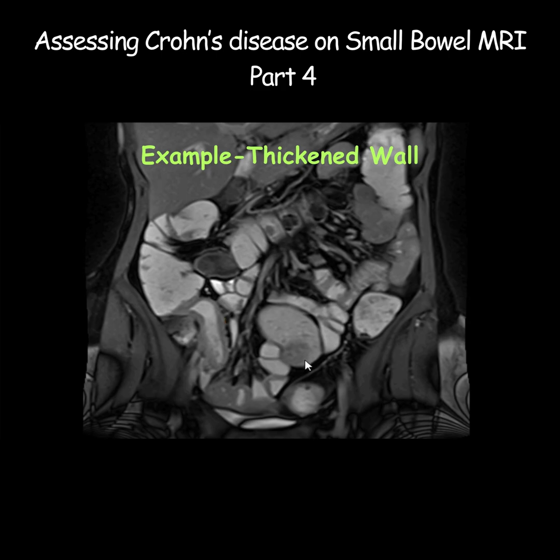The question to ask is: is this small bowel loop adequately distended for me to call it abnormal bowel wall thickening? Well, yes, it is adequately distended.